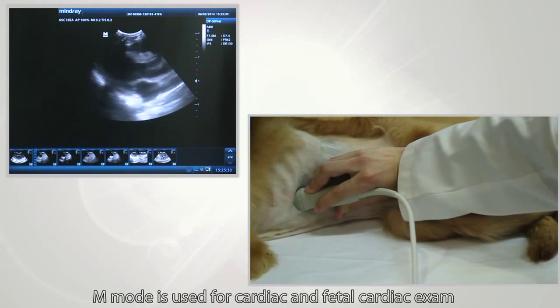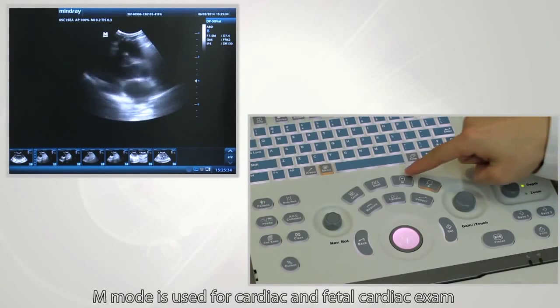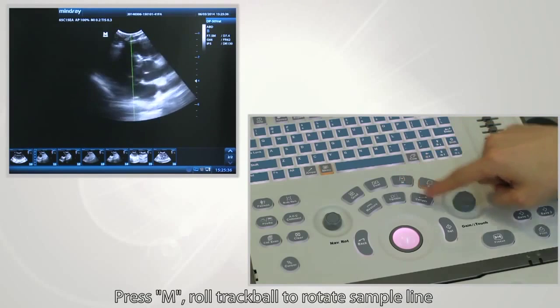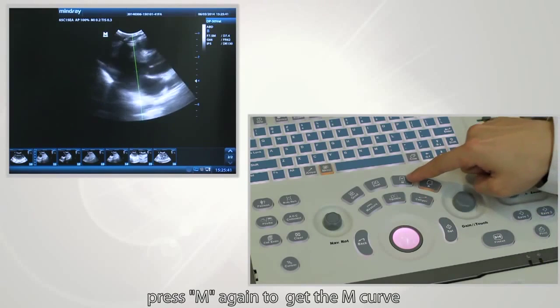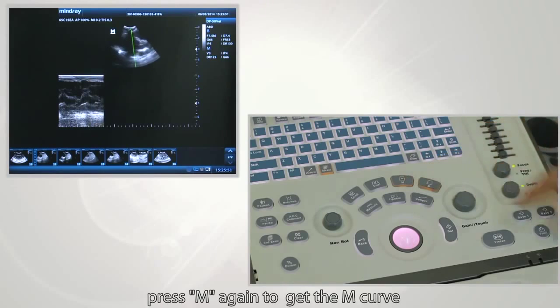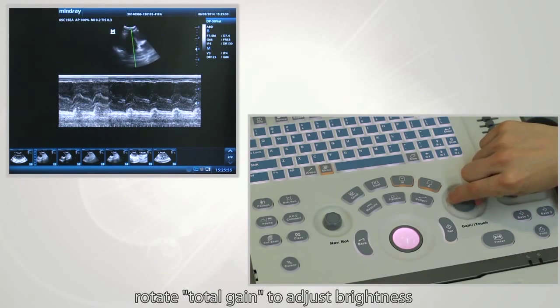M-mode is used for cardiac and fetal cardiac exams. Press the M button, roll the trackball to position the sample line, then press M again to get the M-mode curve. Rotate total gain to adjust brightness.